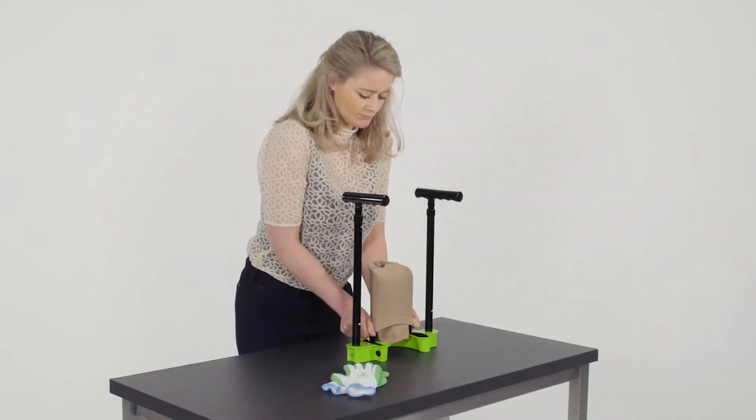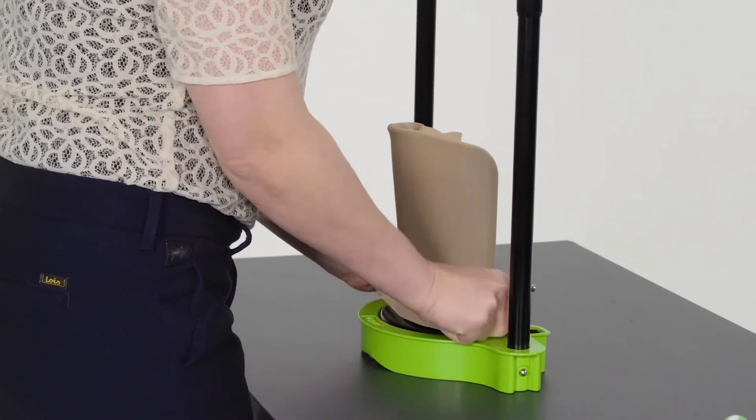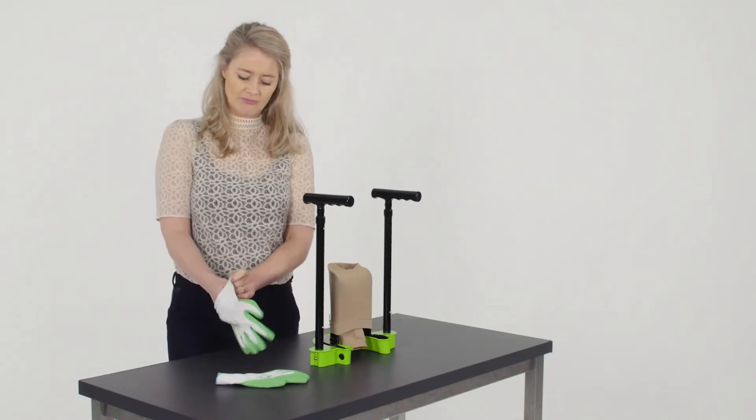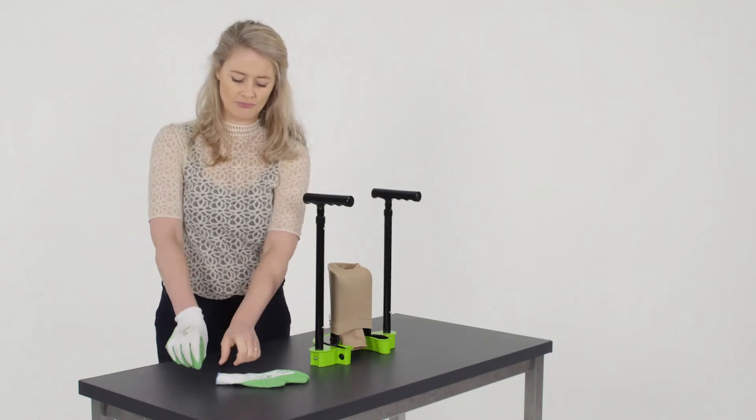Place the stocking on the donning shovel and slide the back of the cuff over the donning shovel and pull the stocking down. Put on the special Steve gloves to maximize your grip.